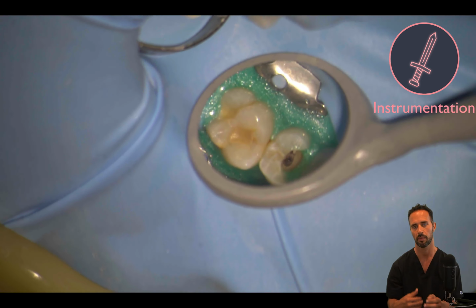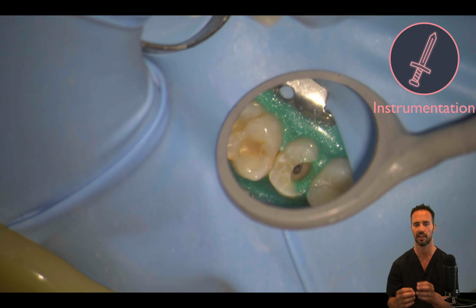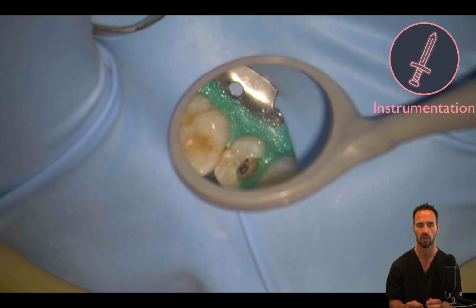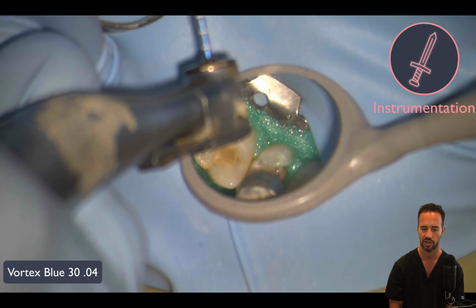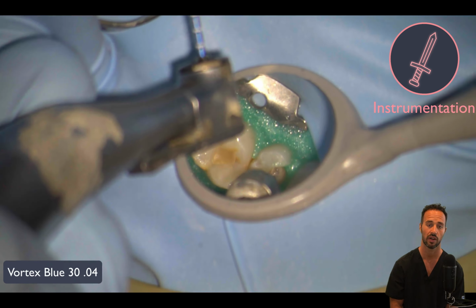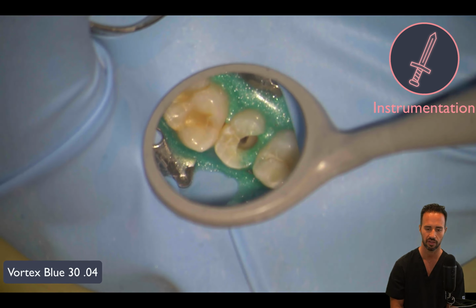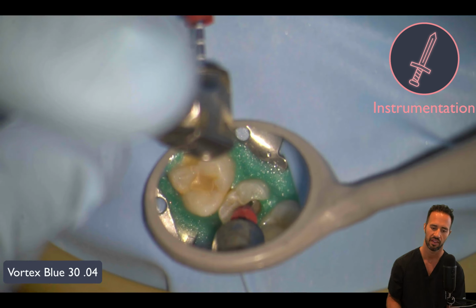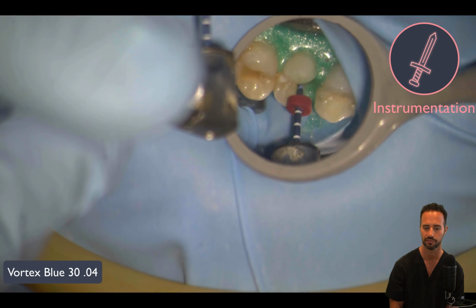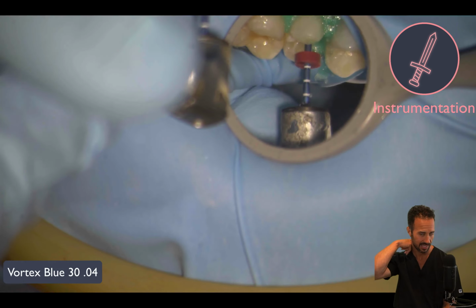This gets a little bit repetitive here, but that's nice because then your assistant and you can kind of do the dance and get through all the steps in a very predictable manner. That's the whole idea. All right, now we are moving right along to our size 30 .04 Vortex Blue rotary file. In the buccal, wipe, RC Prep, and then into the palatal. And we're going to go up one more size in this case.